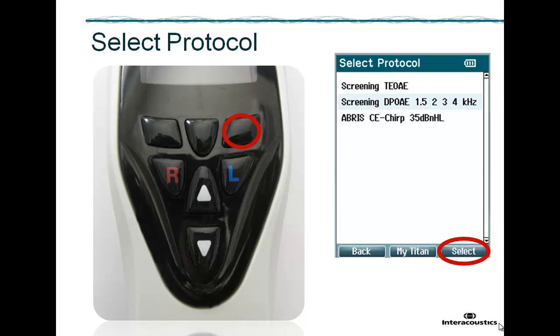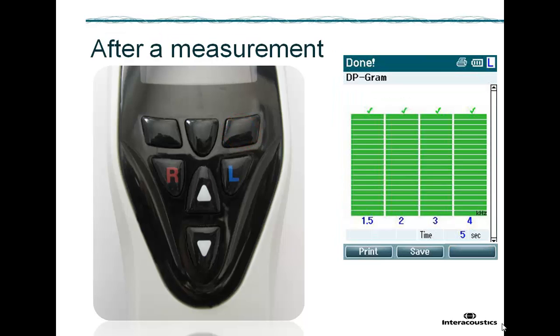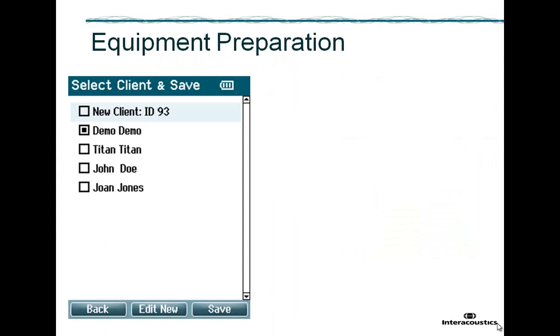Running a measurement and what to be aware of related to that measurement is explained in a separate video. You'll notice that when a test has been started, regardless of the outcome, you must save the results to the selected client before you can repeat a test or select a different client. Even switching off Titan will not delete data. After having measured both ears and once the save button has been pressed, the screen will change back to the select client screen where you can select the same or a different client for your next measurement.